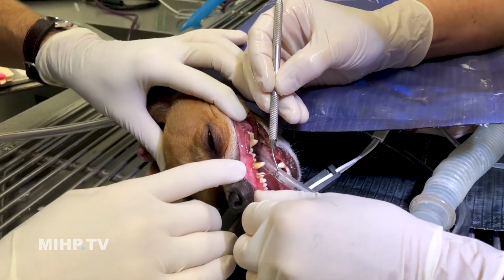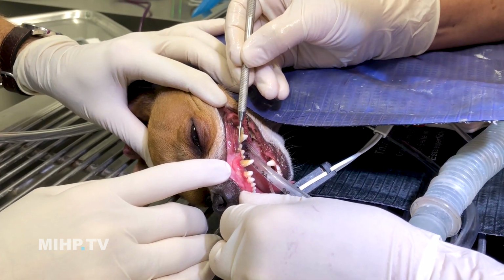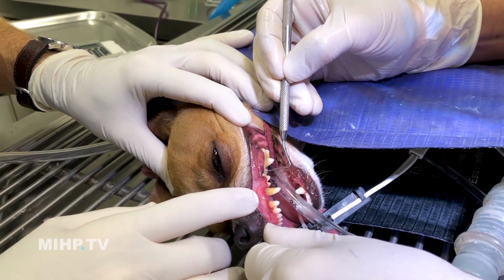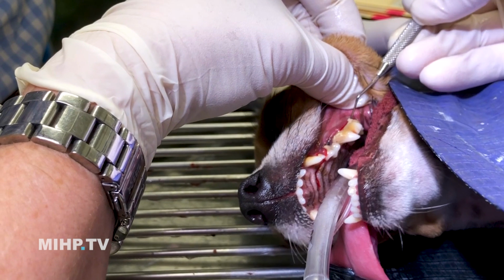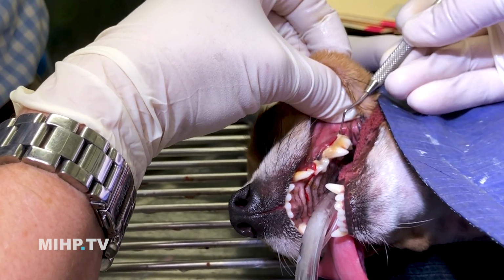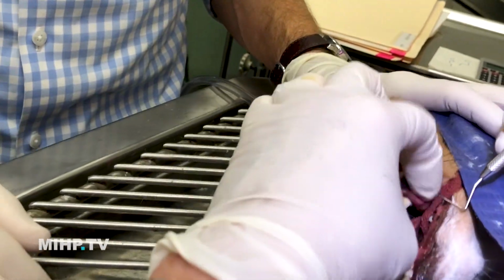So this is what Ginger usually does. She does the probing for us, and she'll come and tell me if there's anything specific. Yeah, right. A bit of gum recession there, but we'll clean it up. This is a little bit of overlapping. Is that back one loose? Yeah, I don't know. We'll see when it's a little bit loose. So loose, that one. Probably lose that one. Yeah. What about that third premolar? What do you think? It's okay.